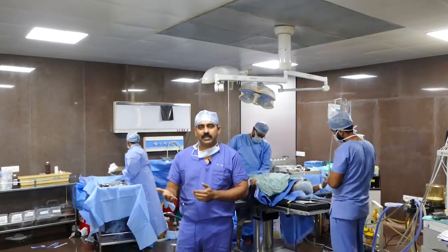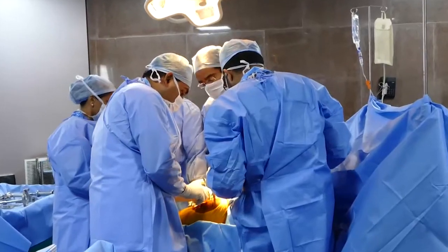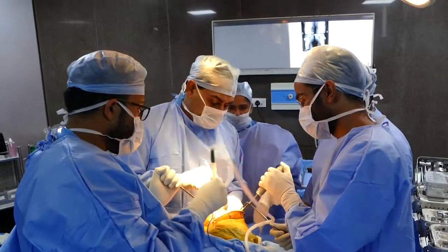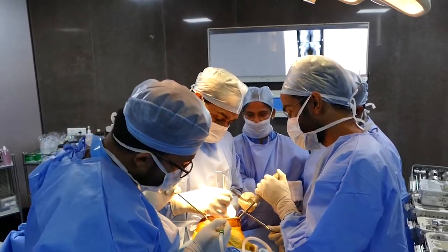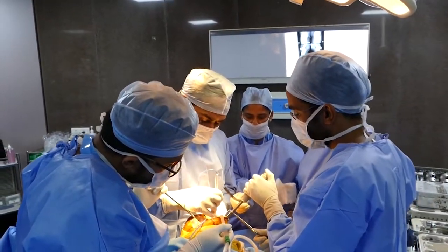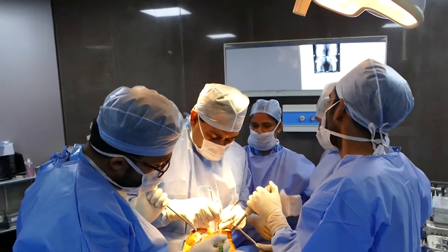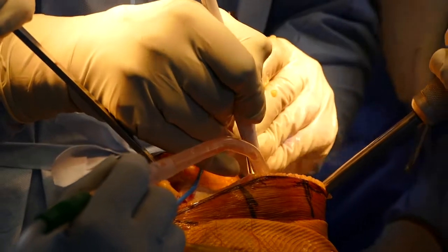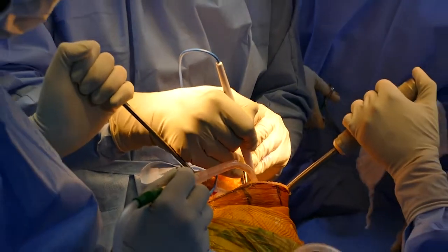Once the surgery starts, we make the incision on the skin and the joint is opened, and we see that all the damaged tissues are removed. This is how the joints will be totally deranged in the case of severe arthritis. All this is cleared, and the joint is prepared for taking the implant. Prepared means few cuts are made in the bone, where you prepare the bone for taking the defined shape of the implant.